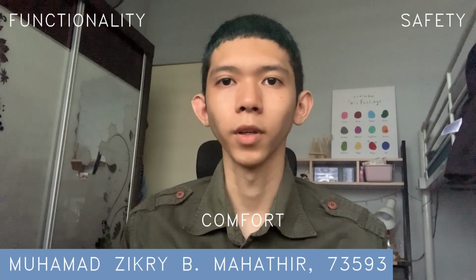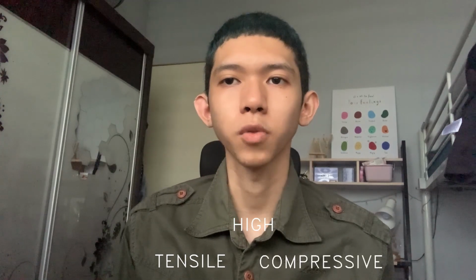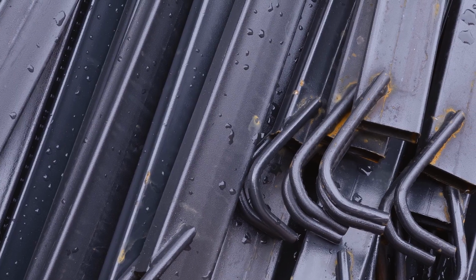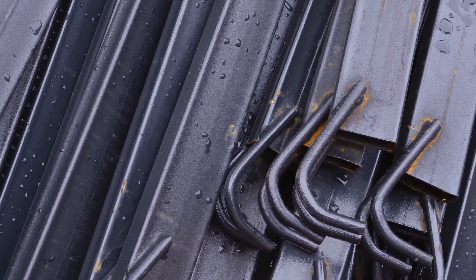Now, the design of the wheelchair, as we said, prioritizes safety, functionality, and comfort. Therefore, we opted to use aluminium as our material for the frame. The reason behind this is that aluminium has a high tensile and compressive yield strength. Also, aluminium has the benefit of being resistant to corrosion. Aluminium is significantly cheaper than other materials such as titanium. Also, aluminium has a low density, which makes it lightweight and portable.